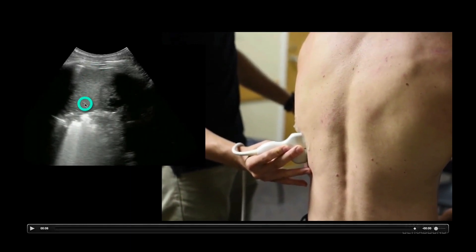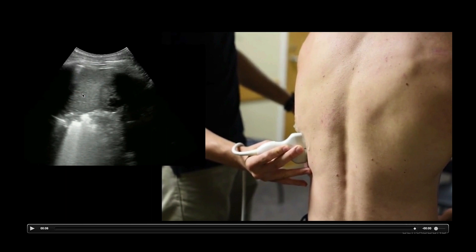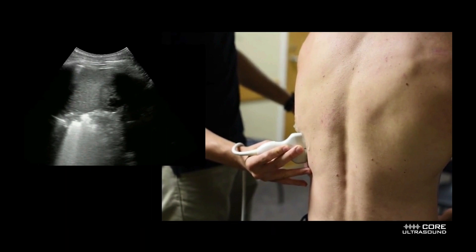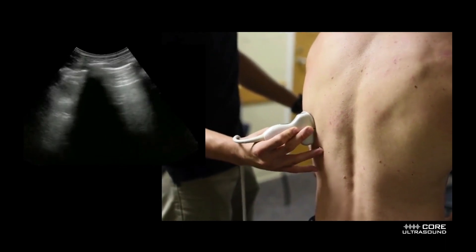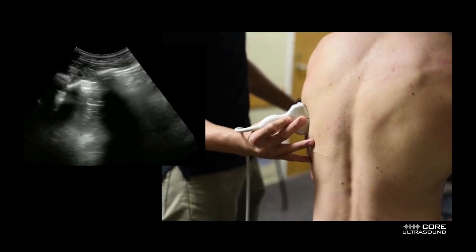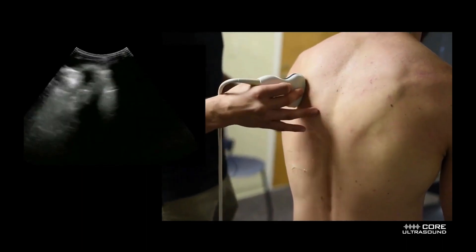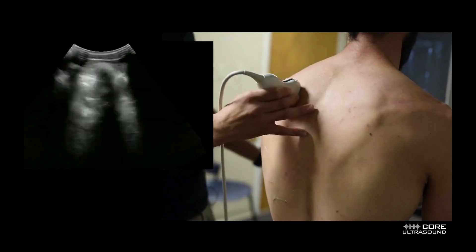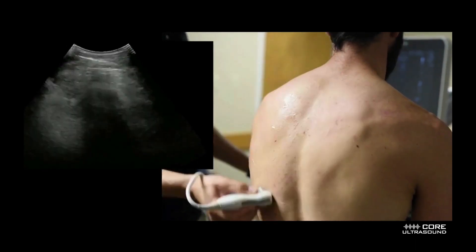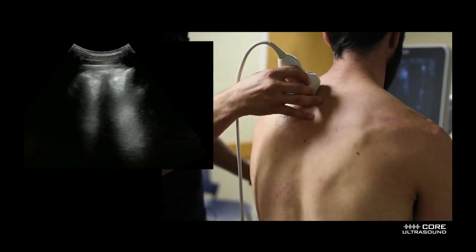The most important part is the posterior area, so I'll go down until I know I'm right at the bottom. Here I've identified the spleen, so I know that if I go one or two rib spaces above the spleen I am in the most dependent portion of the thorax. Then I'll fan back and forth, always keeping an eye on that pleural line. Remember the lung goes all the way up, and don't forget to look in between the scapula and the spine — there's still lung up there.